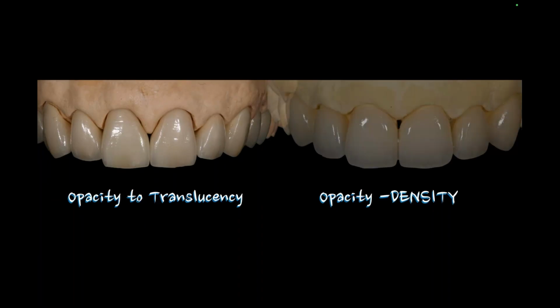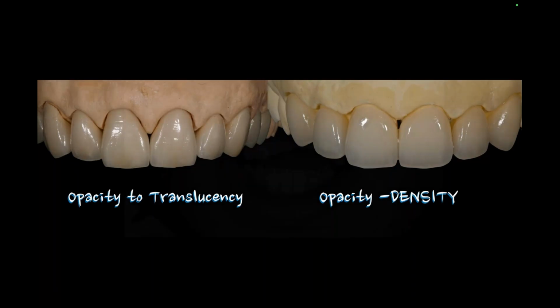Whereas with more youthful teeth, we want more of that translucency to pass through the teeth, but yet we've got to keep value up. So again, we're fighting the game of, if I put too much opacity into something, then I lose the ability to control what the light does. It just becomes either reflective or absorptive. If I put too much translucency or I lower value too much, then I don't have the brightness that I want. So the game is balancing those two things over and over again, which makes it really challenging. I like the word density better, to be honest with you. I think density is really a better fit.